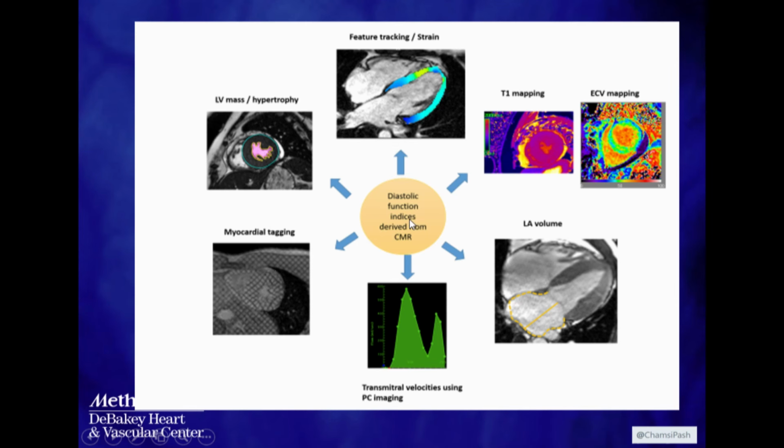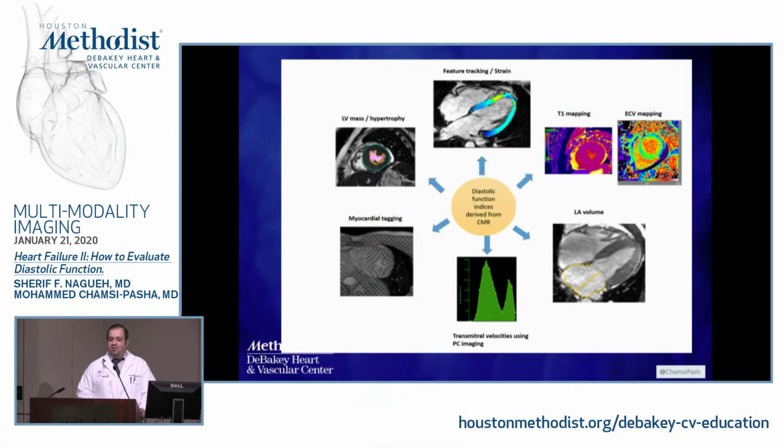So my final take-home message is that you're never going to send a patient for MRI to assess what their diastolic function is or calculate their filling pressures. This is what echo is born to do, and I'm very pleased to talk after Dr. Nagueh, who has been the maestro of diastology.